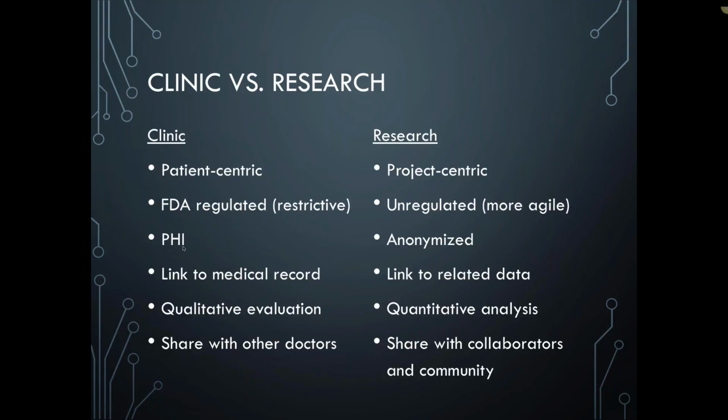On the clinical side, it's important, obviously, to be able to link with the broader medical record. On the research side, we're interested in linking with potentially very large amounts of non-imaging research data. So things like behavioral assessments or case report forms or genomics.